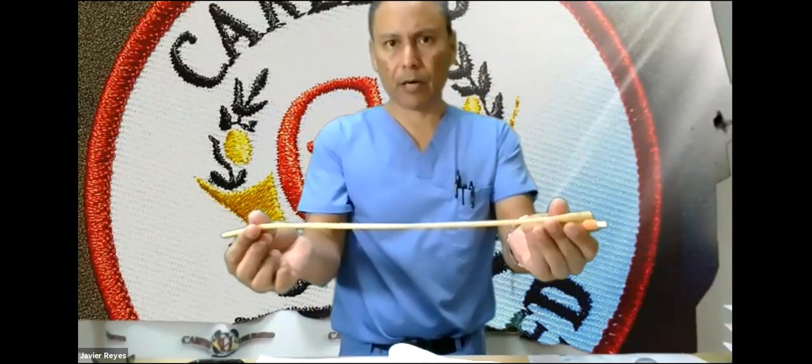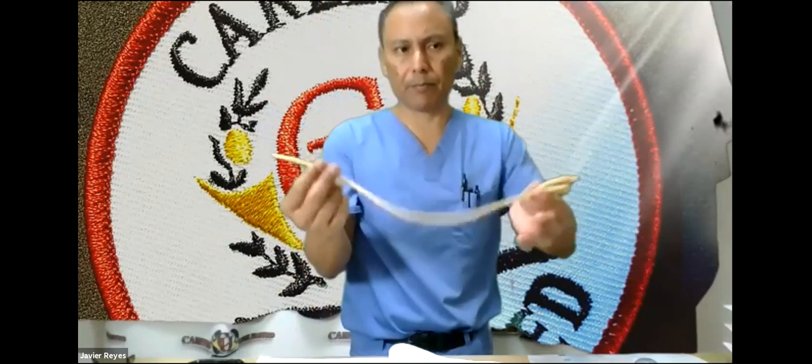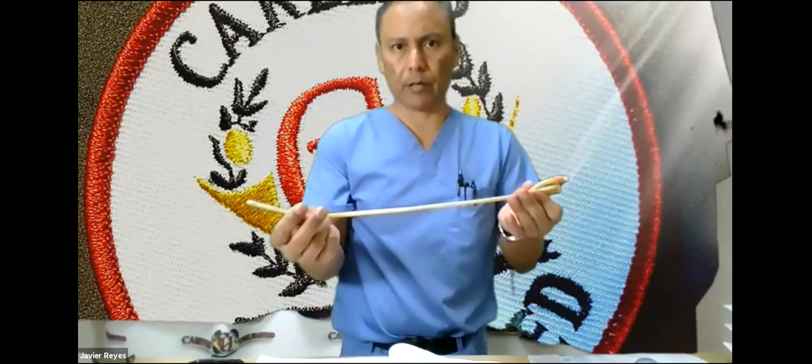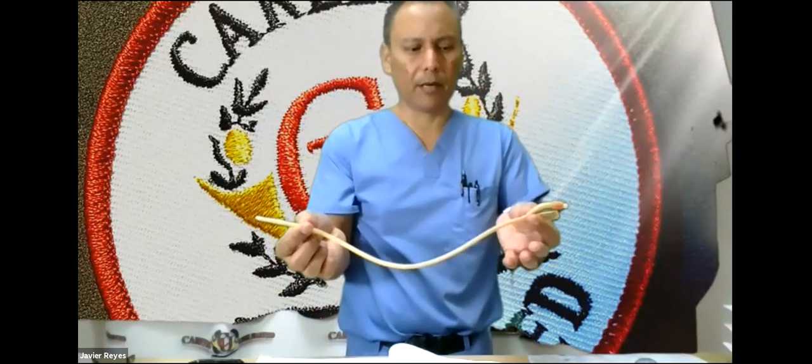Whatever the doctor prescribed is what we place in there. In this case, the doctor didn't specify a measurement, so I went with the standard, which is 18. 16 is kind of the standard, like everybody does 16, but I went ahead and did an 18 French catheter on this person.